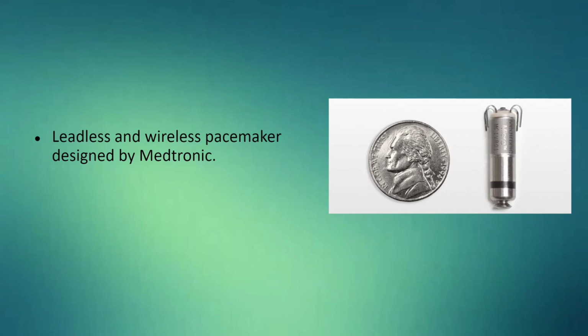So the last and I think the most important study is the development of the leadless and wireless pacemaker introduced by Medtronic. New leadless systems that can provide pacing to one chamber of the heart are now available. However, pacing therapy is typically delivered to multiple chambers of the heart in a synchronized manner, and the bulky size and shape of the new leadless pacemakers don't allow for multiple chamber pacing, but it can still be considered the best development of recent times.